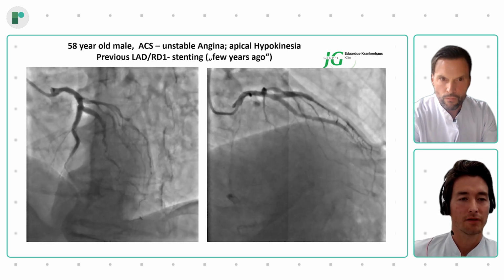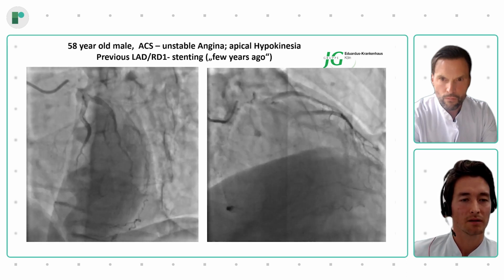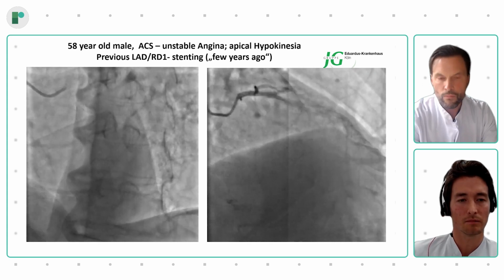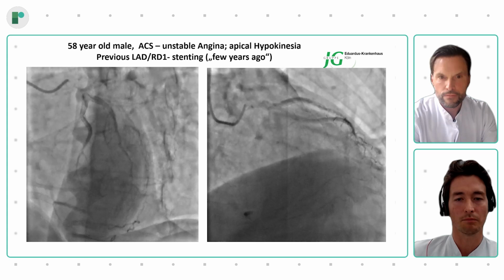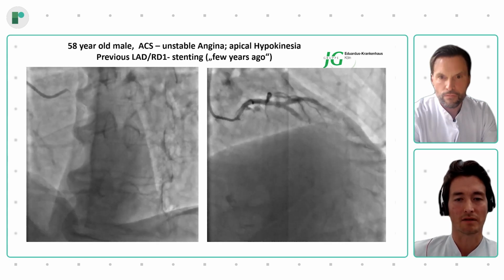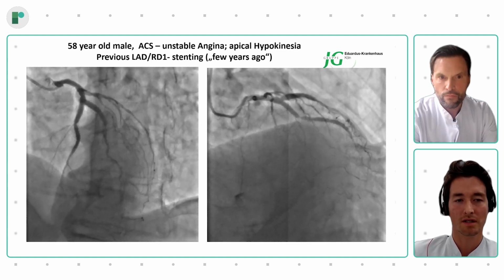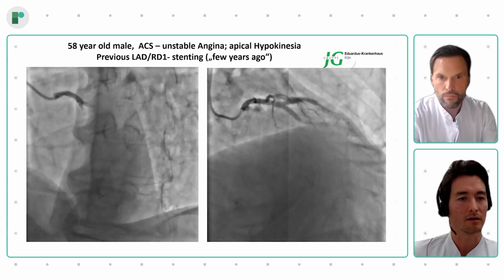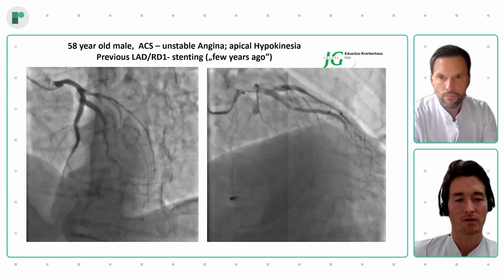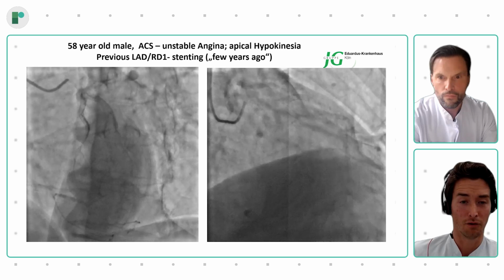So after having done a very quite theoretical part, I would like to proceed by showing you a few, I think, very nice cases which depict the importance of the really generous use of HD IVUS, and do not rely on your angiography alone. Of course, there are settings where you can leave intravascular imaging aside, but I would strongly advise you not to trust your angiography fully.